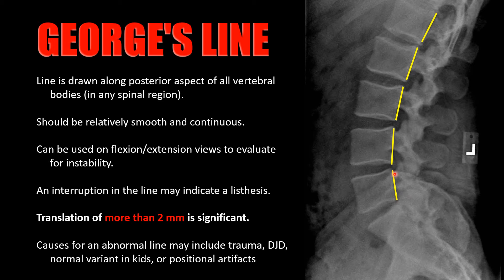With George's line, lines are drawn along the posterior aspects of the vertebral bodies. You are looking for at least two millimeters of anterior or posterior translation. Less than two millimeters of translation is not statistically reliable, so we're looking for at least two millimeters to call it a listhesis.